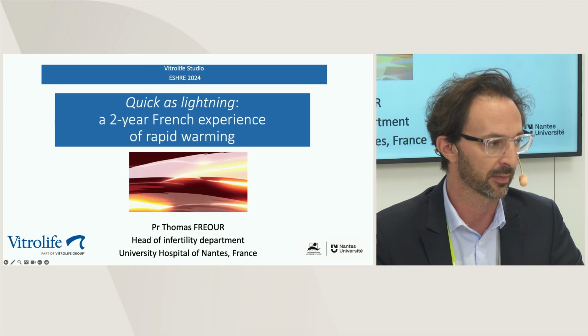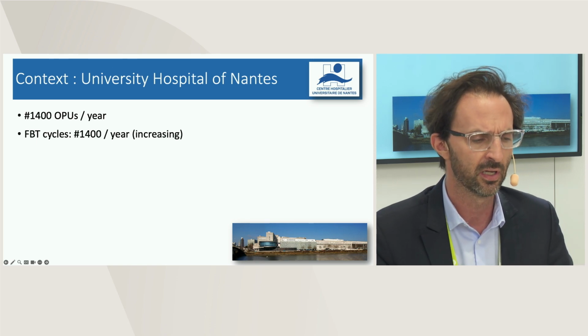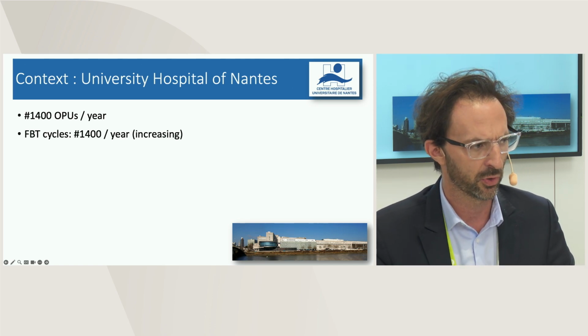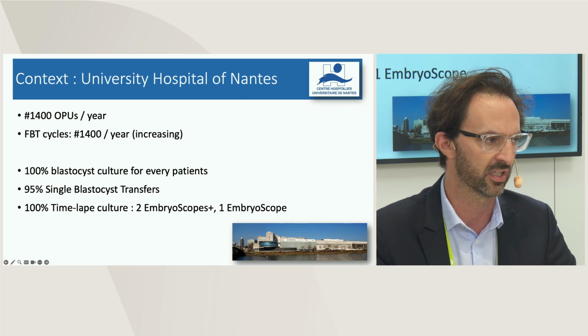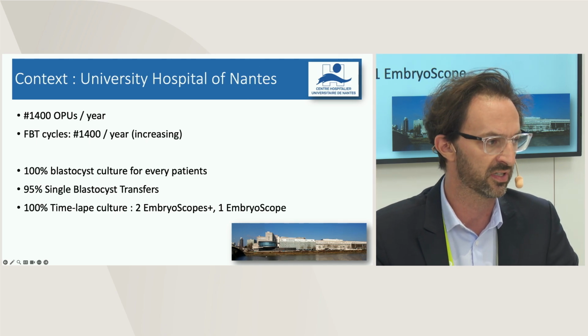Okay, now I'm going to share with you my experience, my 2-year experience now with rapid warming with the Vitrolife media. So just a little bit of context. I'm the head of the IVF department of the University Hospital of Nantes in France. So it's roughly a middle-sized IVF unit, at least for France. We do more or less 1,400 ovum pickups a year, and we have approximately the same number of frozen blastocyst transfers. And actually, the embryo culture and embryo transfer strategy is 100% blastocyst for every patient, no exception. And we do more or less 95% single blastocyst transfers. And we culture all our embryos in time-lapse culture because we use the embryoscopes.